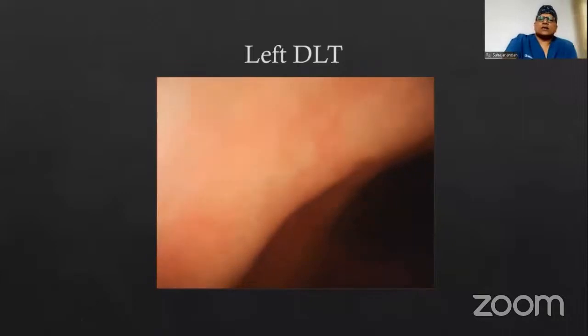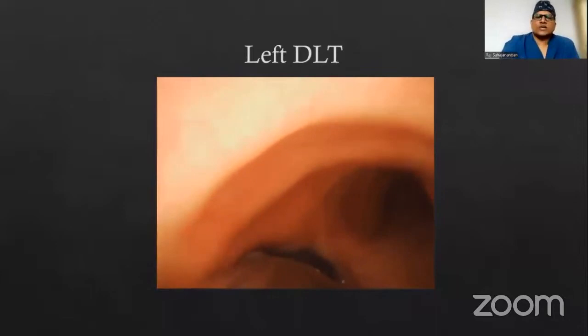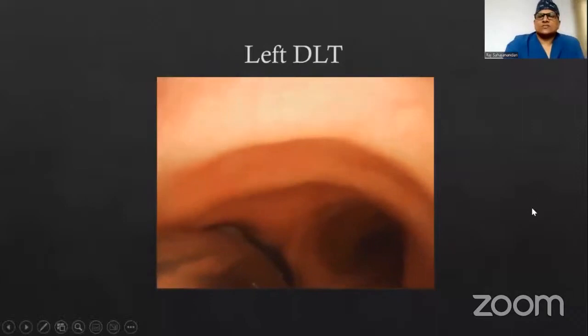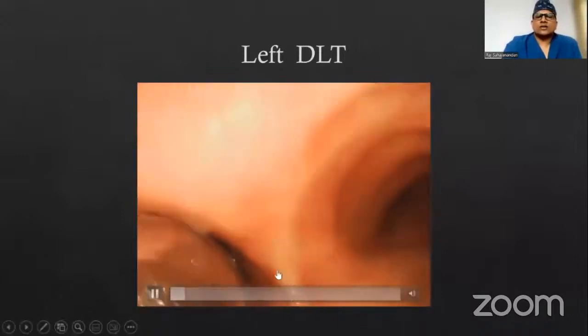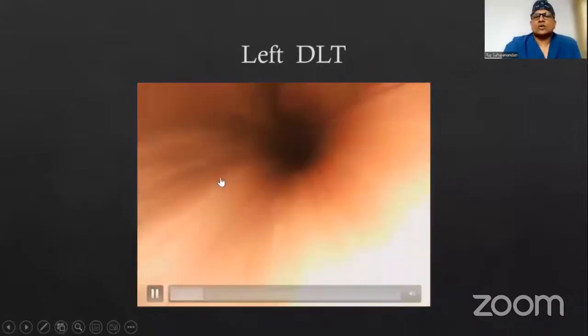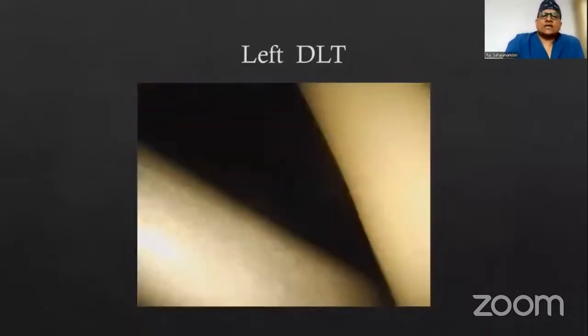It's very important. If you have not visited Toronto General Hospital's bronchoscopy simulator, it's a worthwhile exercise. Okay, once this is done, we have seen the blue cuff just distal to the carina. That is good enough. Now you go to the other side, so you come out of the tracheal lumen. Here I have pushed the blue cuff a bit more inside. This is for you to understand the margin of safety. Once I have done it, we'll go to the left side.